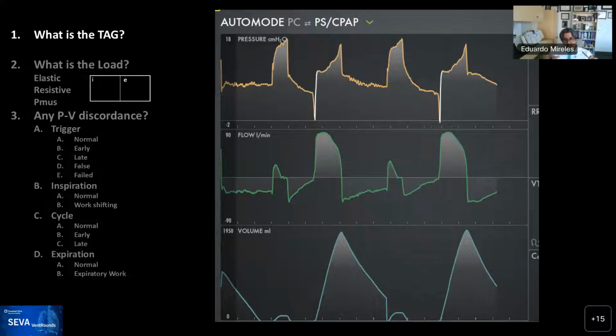Otherwise, you become a passive observer of life. Right now, you have to put it in and see if you're going the right way or the wrong way, and we can discuss it. This graph has a lot of information, but it's good for us to go at it. All right, they're starting to come in.